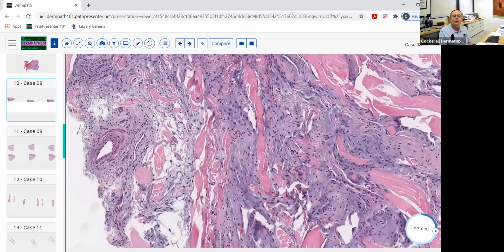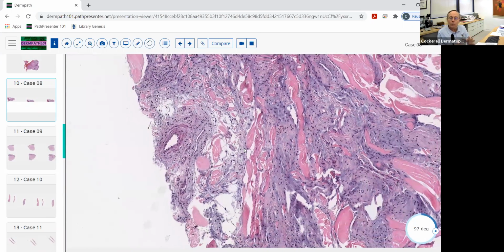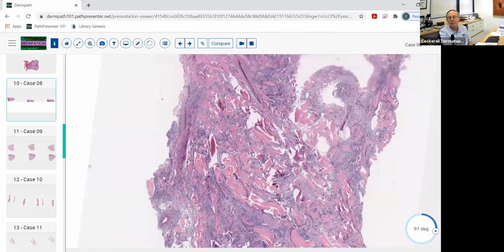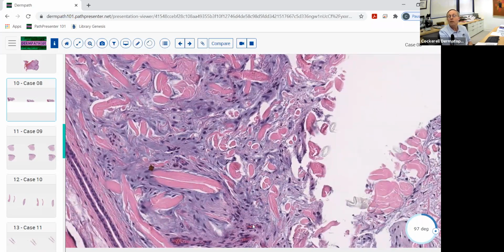So guess what the diagnosis is called here? It's called a cutaneous acral fibromyxoma. Fibro, again, with fibroblast, myxoma with mucin. So it's a superficial, relatively superficial, as opposed to being deep in the soft tissue, acral fibromyxoma. So that's the name of this entity. And just realize, you probably aren't going to encounter these very frequently. I don't think the board examination is going to expect you to diagnose this. It's more of a clinical perspective.